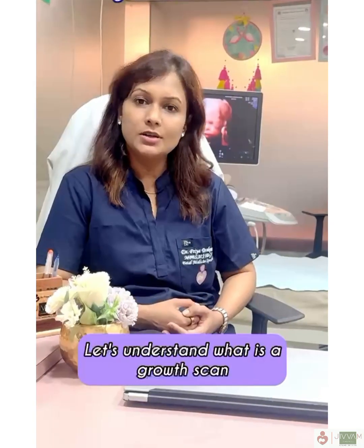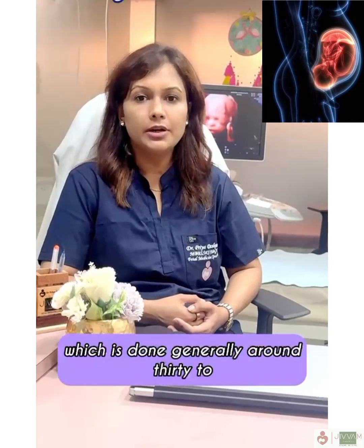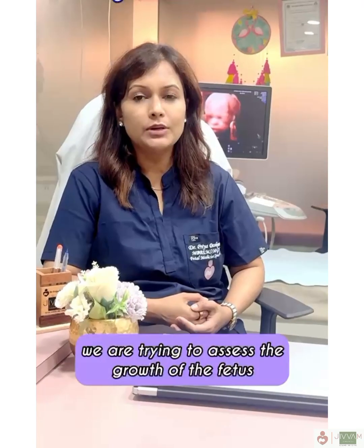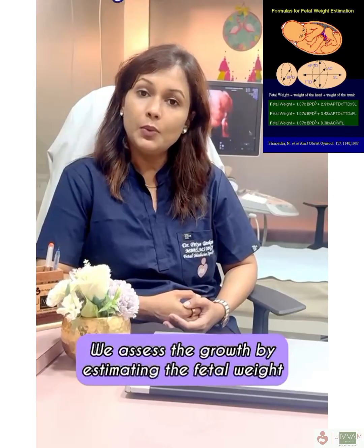Let's understand what a growth scan is. A growth scan is done generally around 30 to 32 weeks of pregnancy, and the second one is done around, say, 36 weeks. As the name suggests, we are trying to assess the growth of the fetus. And how are we going to assess it? We assess the growth by estimating the fetal weight.